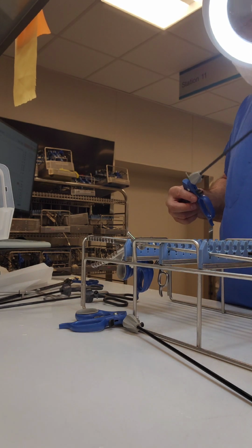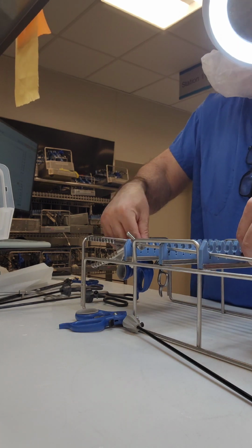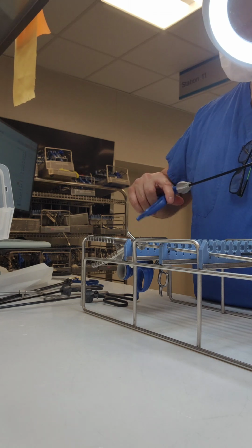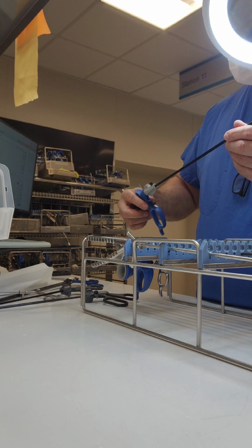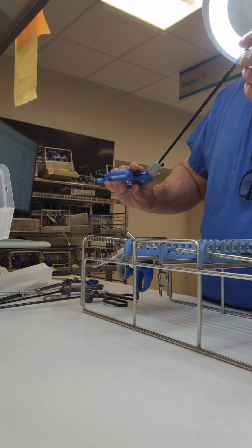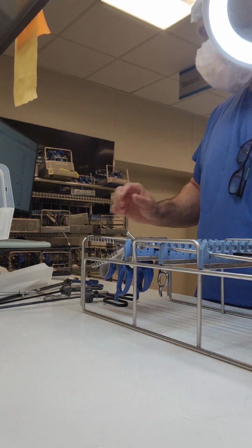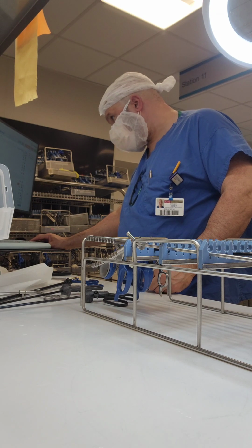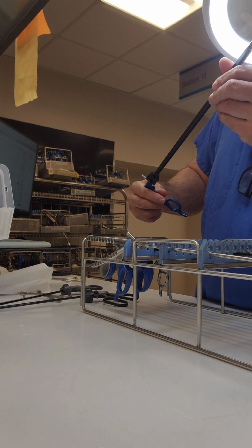Okay, that's the next instrument on this count sheet. Okay, getting that space right there. There you go. Again, checking the part numbers. And again, this is all part of the inspection process, because even when I'm looking at the part number, I'm looking at that handle, making sure that there's no soil on that handle as well. Again, a second, third look. You see how many times I touch this instrument, right? And again, it's all part of the quality process, making sure everything's good.